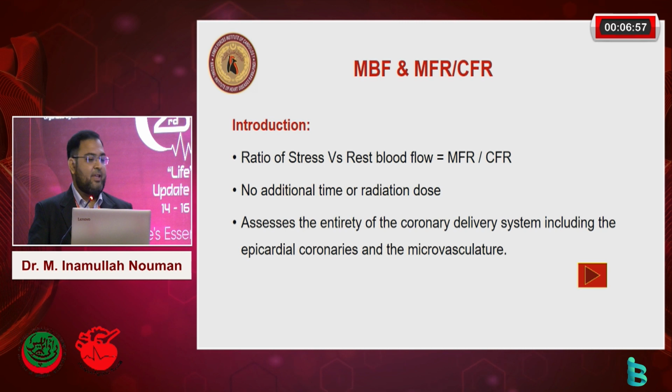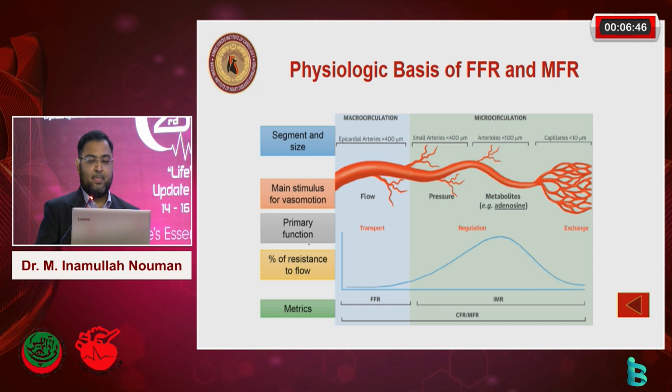It does not involve any additional time or radiation dose, and it assesses the entirety of the coronary delivery system, including the epicardial coronaries and the microvasculature.